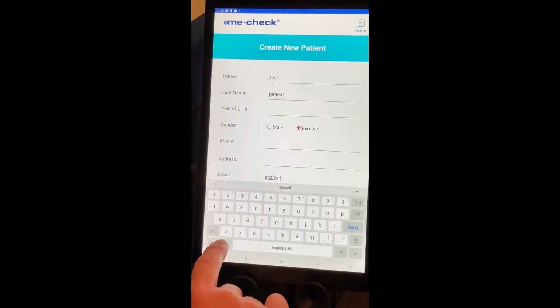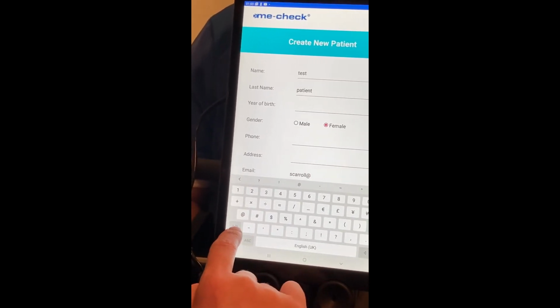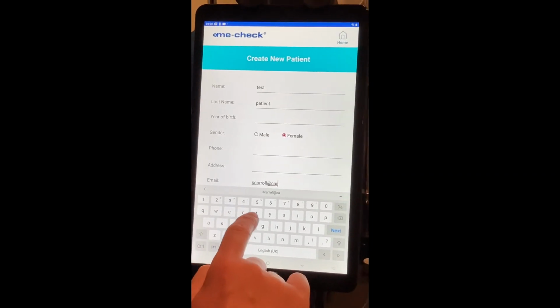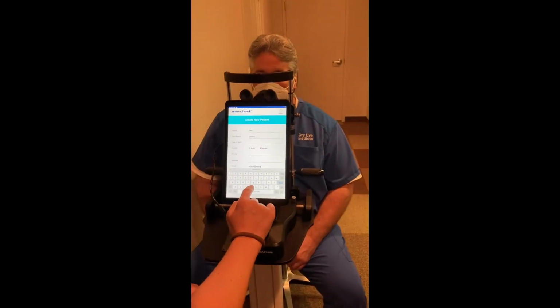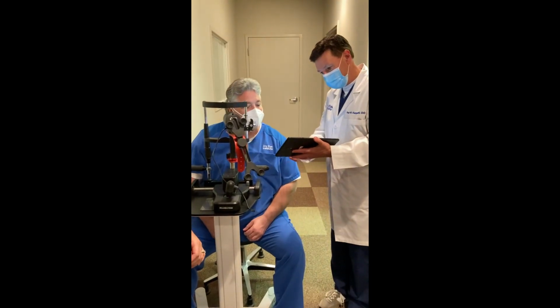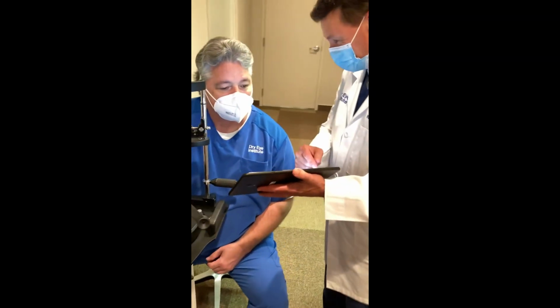And the third thing that's extremely exciting is that I can actually take this device, which is essentially a tablet. I'm able to bring up the images and use it as a teaching tool in instructing my patient. Because Michael, I think now I can show you your meibography images. And what I'll do here is I'll just explain to you what they should look like.